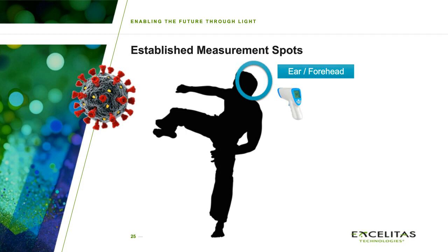Can the single pixel sensor be suitable for measurement of temperature at distances of 1 meter? Only for comparative measurements. So you can say this person is warmer than the other person. The problem with 1 pixel is actually that typically the field of view is too large for 1 meter. Also, with the 4x4 solution on our side, the pixel size becomes very big since we have the same focal length and similar pixel sizes.